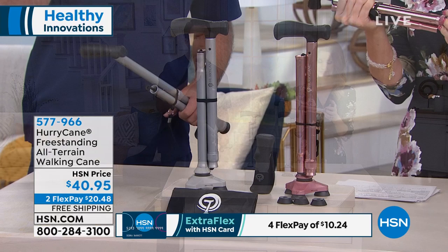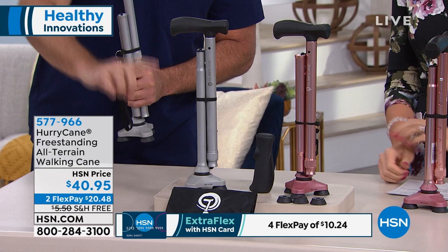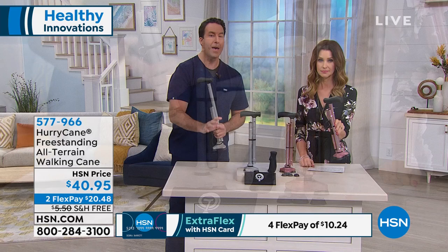There are imitators on the market, so please be aware of this. You'll notice the Hurricane is just over about a foot when it's fully folded. It only weighs a little over a pound, but it's going to withstand up to 350 pounds of weight.